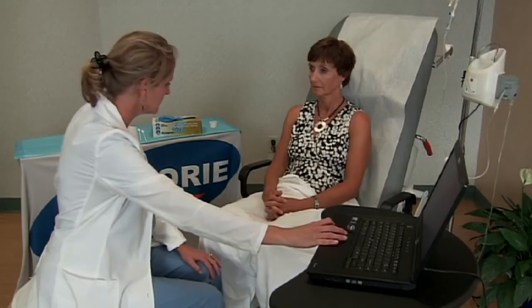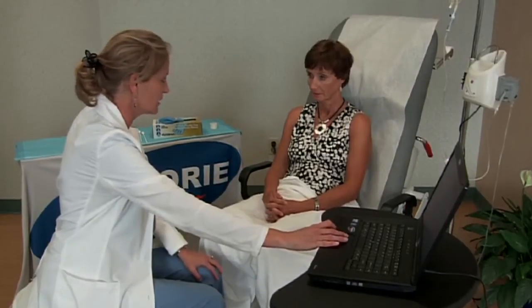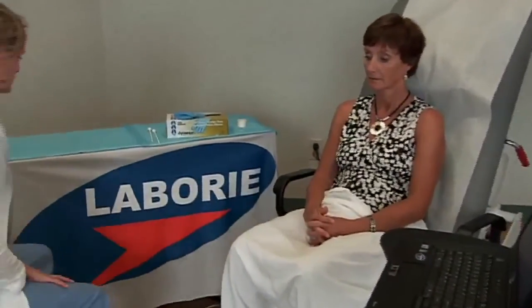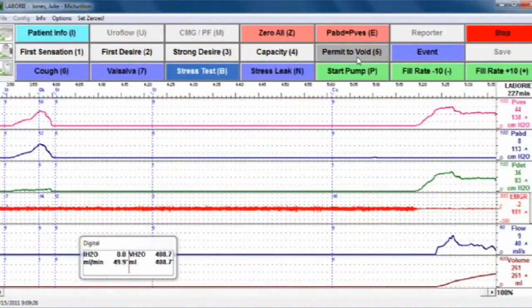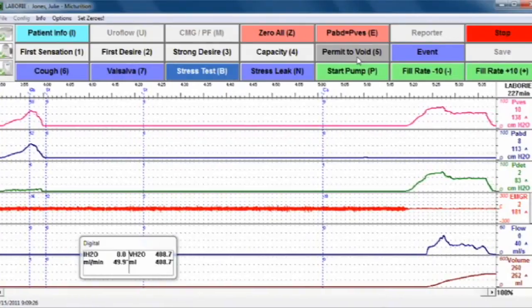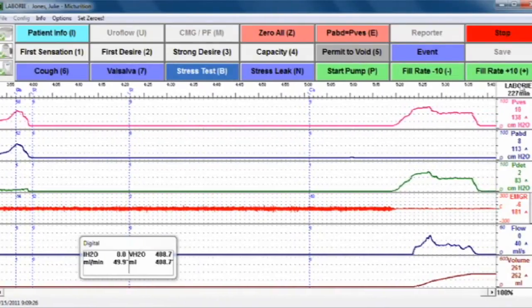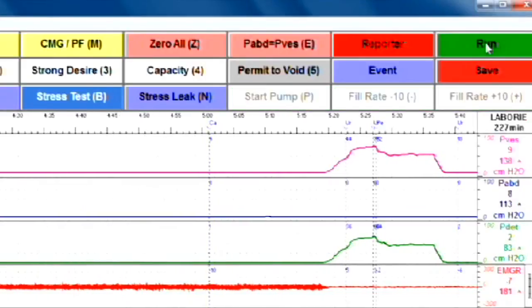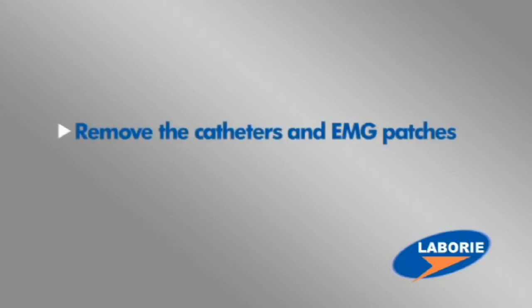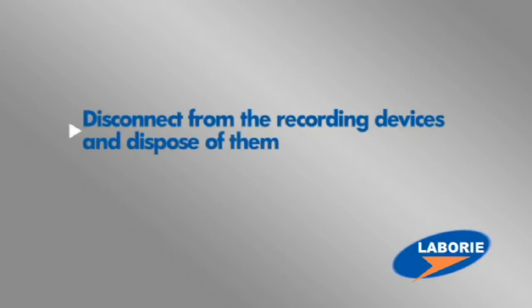At this point, you'll want to make sure that the patient is sitting comfortably on the chair or commode over the beaker with the catheters and EMG patches still properly in place. If it's safe to do so, you may leave the room to allow privacy. The graph will record the pressures as well as the flow and voided volume. When voiding is complete, press stop. With the test now completed, remove the catheters and EMG patches, disconnect them from the recording devices, and dispose of these supplies.